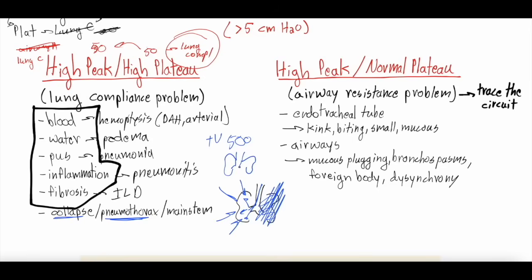And if it's only going into one of the lungs, so instead of getting 250 and 250, this lung has a pneumothorax and is collapsed down. That means now you're trying to put 500 cc's of tidal volume in that one lung, and you're going to over-distend it. You can think of it like a balloon again, right? If you're pushing 250 cc's into a balloon and then you try to push 500, that pressure, that compliance it's coming back down with is going to be more robust.